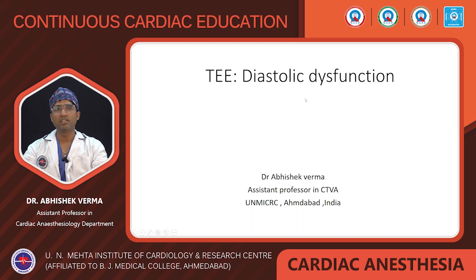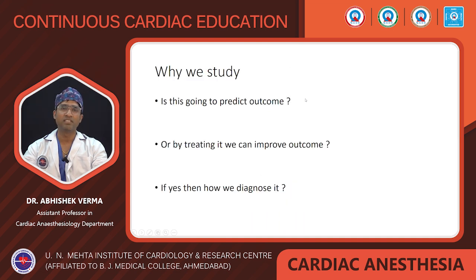Why do we discuss diastolic dysfunction? Why do we study it? Actually, diastolic dysfunction is going to predict outcome. There are many articles which show that if we diagnose diastolic dysfunction very early, we can predict the outcome. And if we predict it, it can be improved by diagnosing early and treating it. So how do we diagnose it? We will see it clinically or echocardiographically.